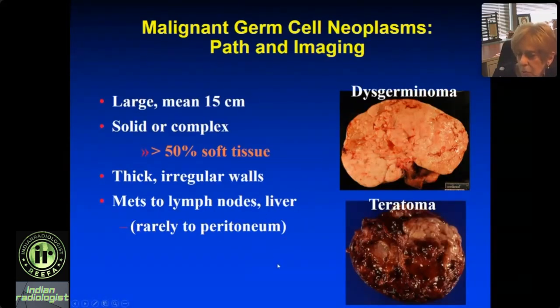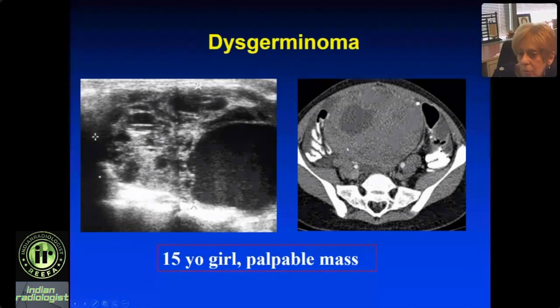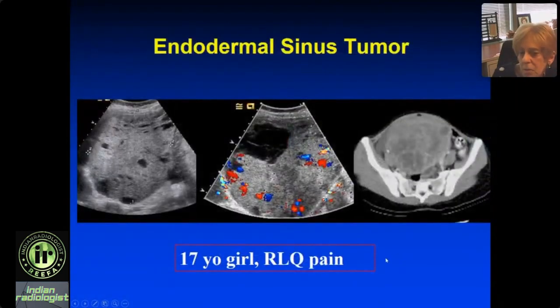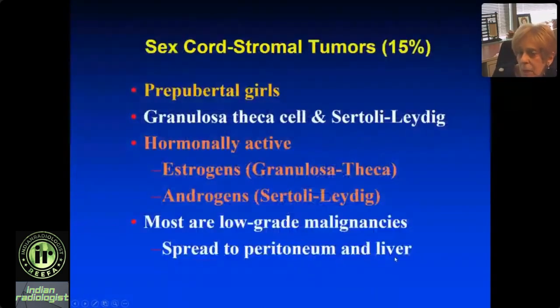A couple of examples: a 15-year-old girl with a palpable mass in the pelvis, only one ovary visible — this is an ovarian mass, predominantly solid — turned out to be a dysgerminoma. A 17-year-old girl with right lower quadrant pain: big mass, predominantly solid, a few cystic or necrotic areas, some internal flow. Given the age, it comes from the ovary; it's solid, so it's a germ cell tumor — this was an endodermal sinus tumor.